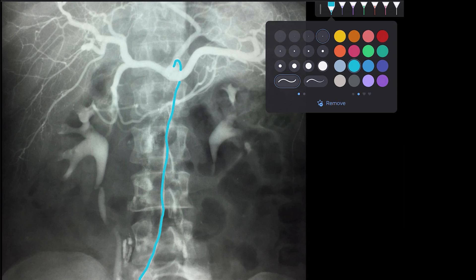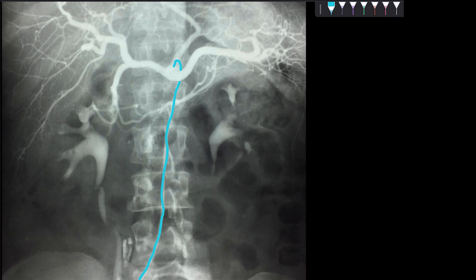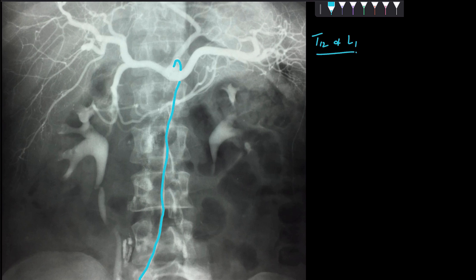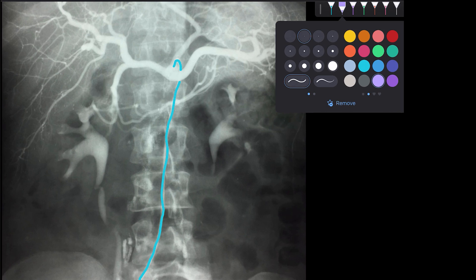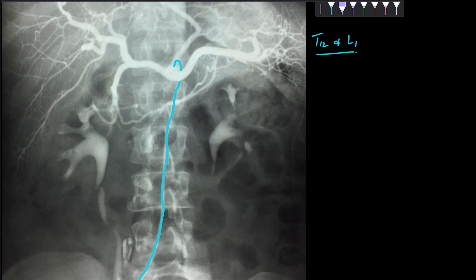This celiac artery is a branch of my abdominal aorta. It is one of the ventral unpaired branches coming from my aorta, and this branch is given off at the level of the lower border of T12 and the first lumbar vertebra. After its emergence, it divides into three major branches.